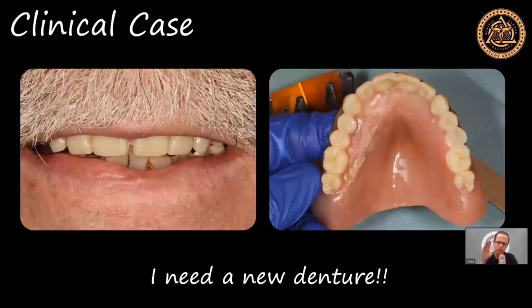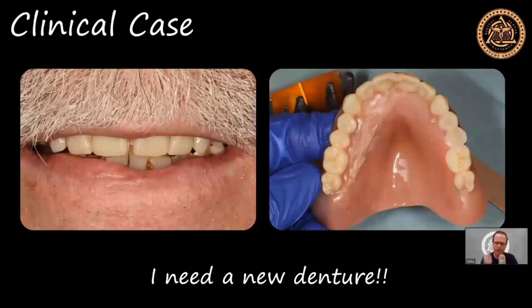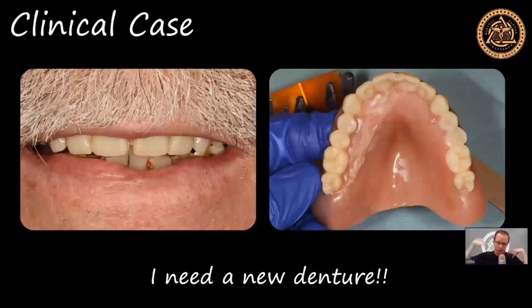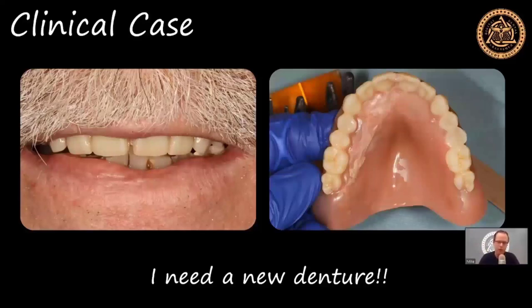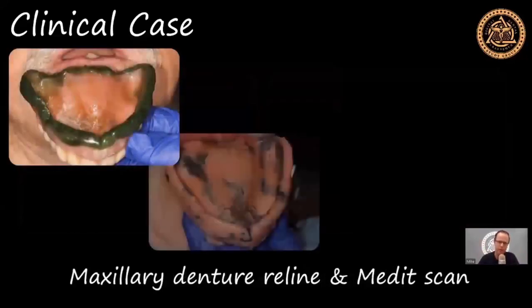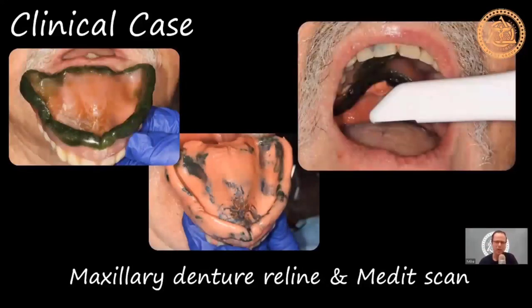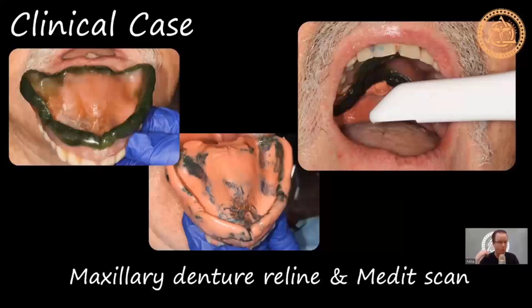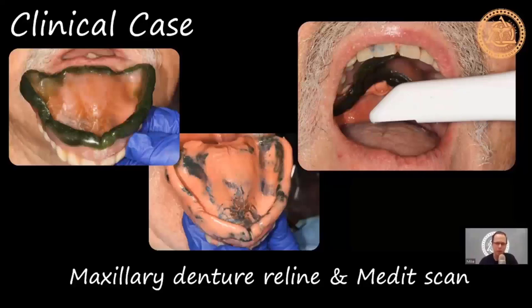Today's presentation is about taking your denture patient who says, 'Doctor, I've got a broken denture,' or 'I think it's time for a new one.' How does the clinician do our work digitally and simply transfer to the technician? What I found out early on is it's basically your analog workflow — except we're going to digitize it. So the analog workflow is taking the patient's denture and border molding it.